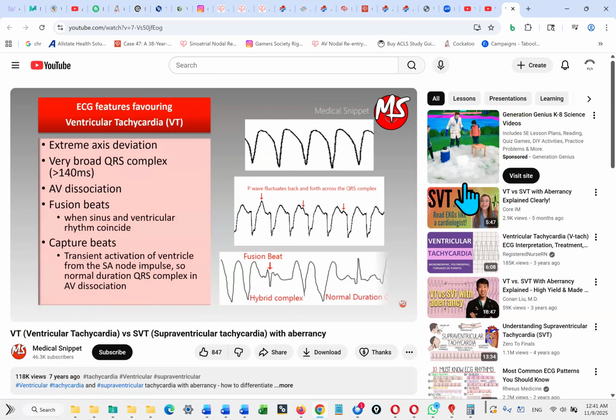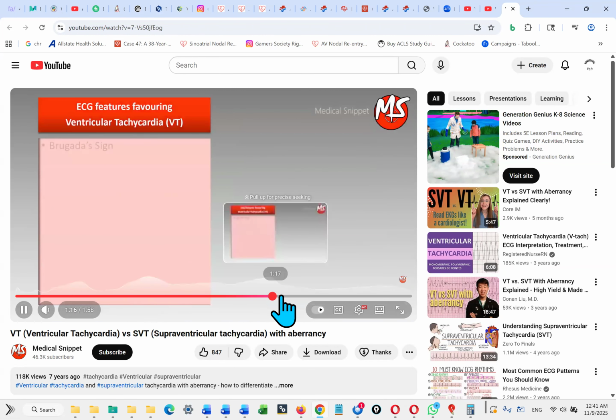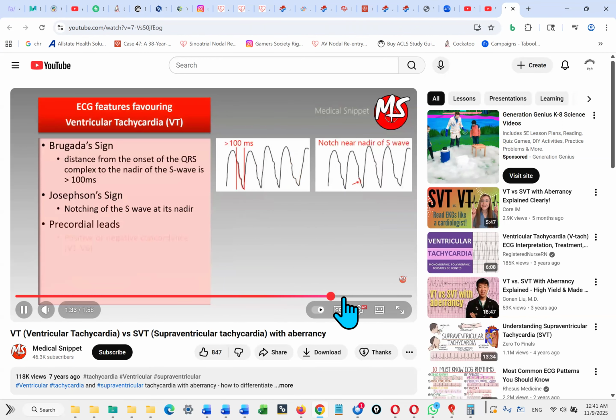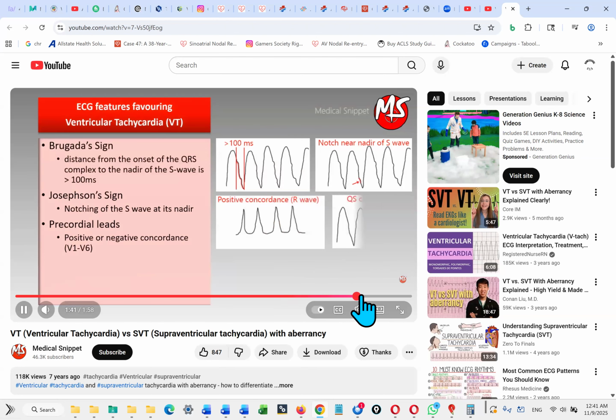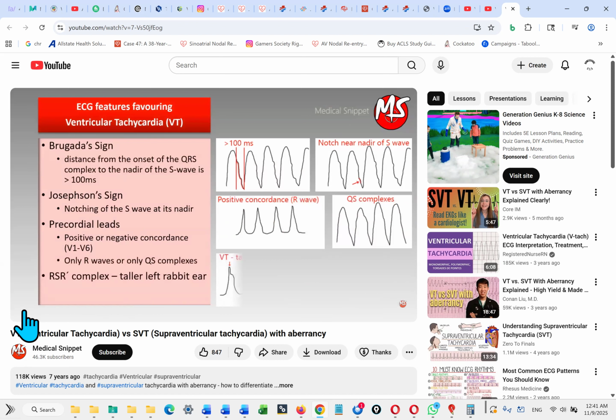There's also more criteria if you could just skip to the rest of the video. Just skip all the way to the end that shows the rest. And these things, yep. These are academic things. So yeah, why not? We can write those things in the exam. But on a practical level, the way ventricular tachycardia is diagnosed is simply from appearance. Nothing else looks like it.